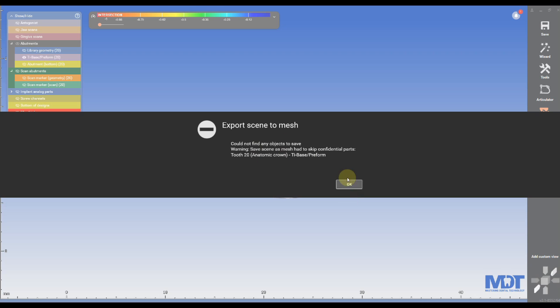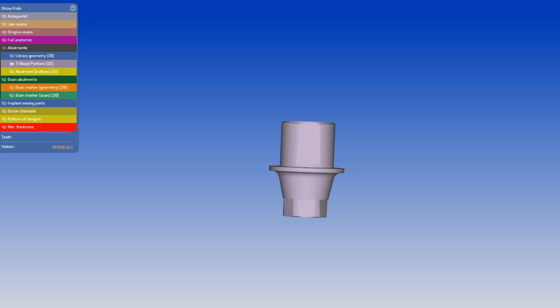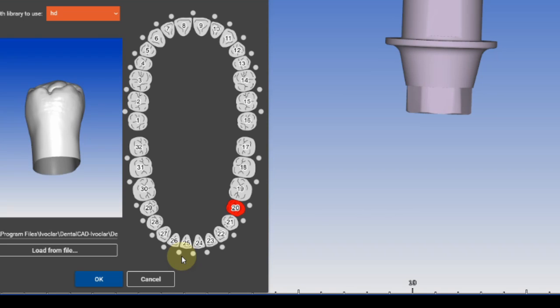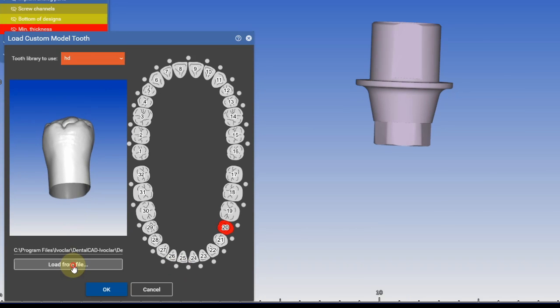If we try to export it, we will get an error message because this is an encrypted tie base from DESS. We're going to go to load tooth model.